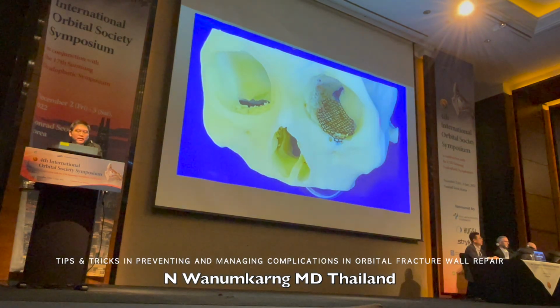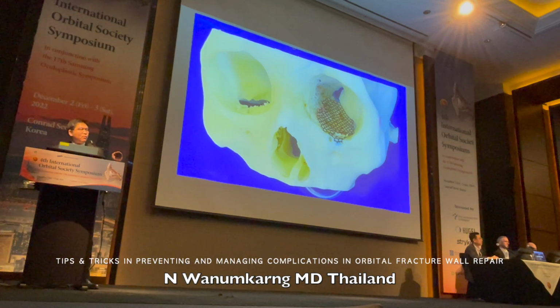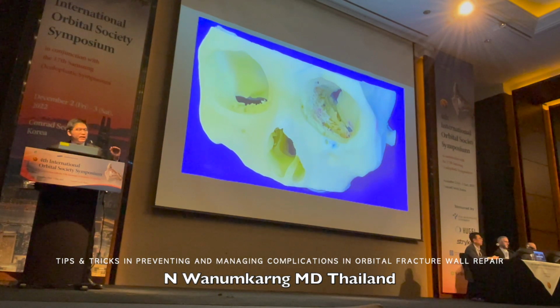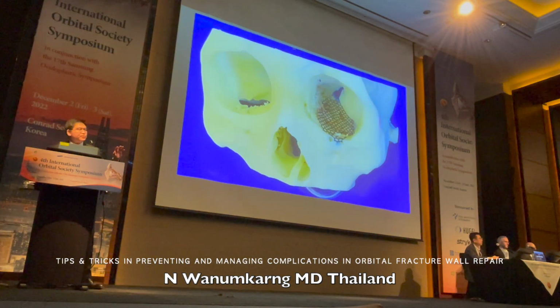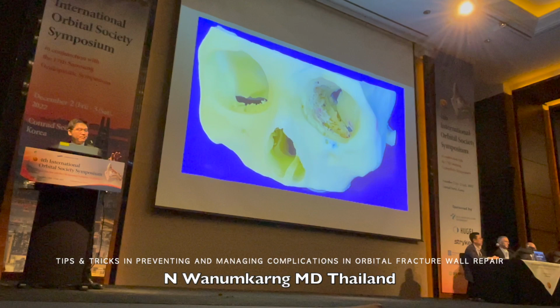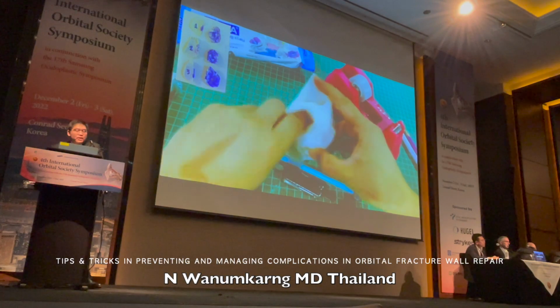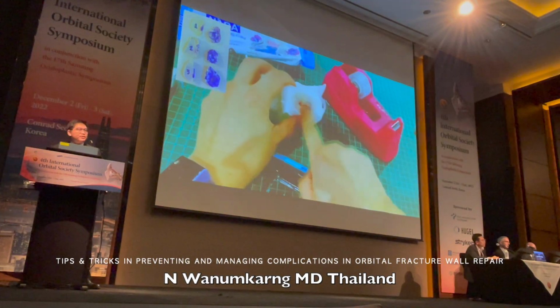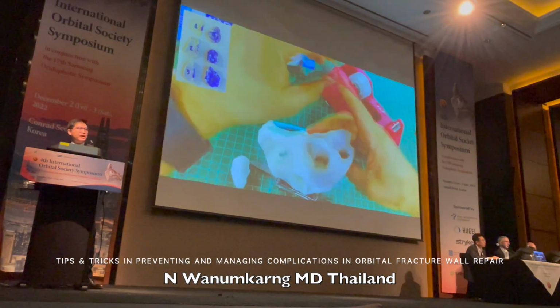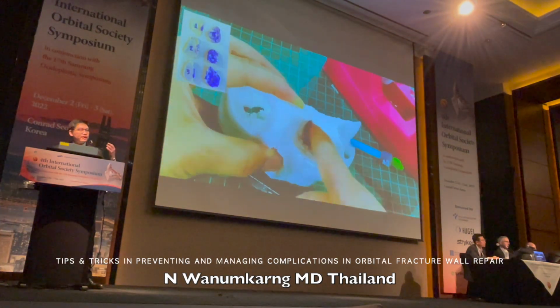So we can use software to evaluate how much the orbital volume increased, and do rapid prototyping. The engineer recommended using software to delete the titanium implant, so we can get the true shape of the bone and evaluate. In this case, I used a technique different from the current PSI implant. The engineer discussed with me, "Hey, doctor, why don't you try to use a PMMA implant? Because we use PMMA for cranial bone defects, and we use it for cataract surgery."